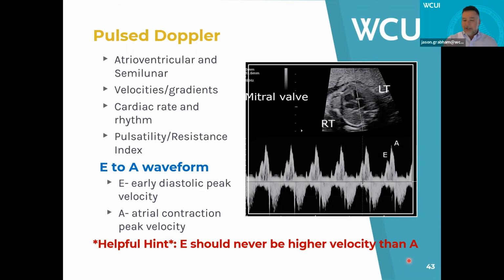So again, you've got your toolbox, and these are all tools that are going to help you better assess the heart.